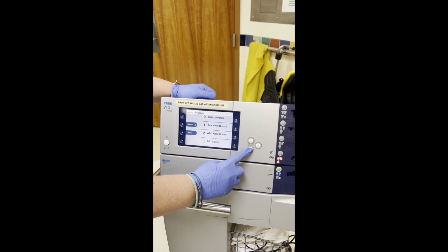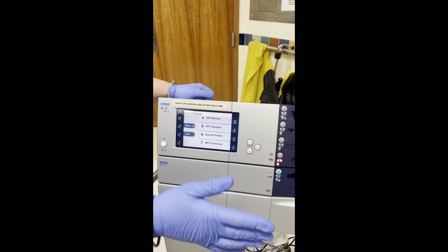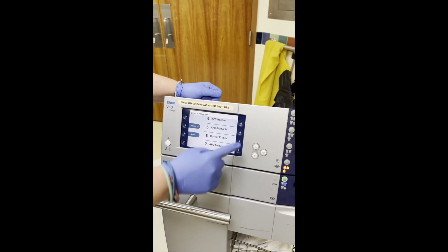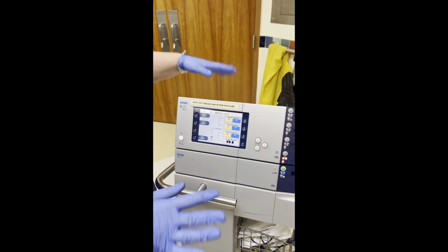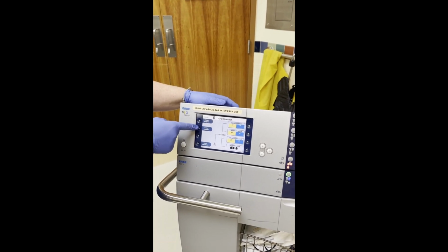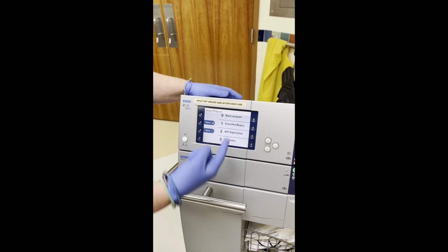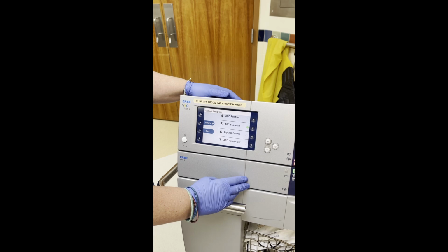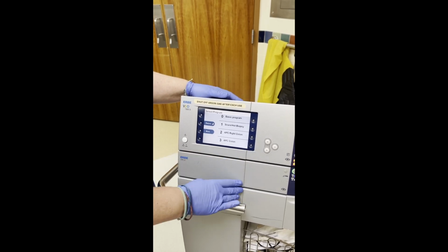So you're going to go down one more time. APC stomach. Generally, that's what you're going to want to do, and then just hit that. That activates it. And if, oh man, I hit the wrong button, no big deal. Just go to select program. It's going to send you back to the selection of the library. And if you miss it the first time, that's okay. Just keep going, no big deal. And then you'll find it.